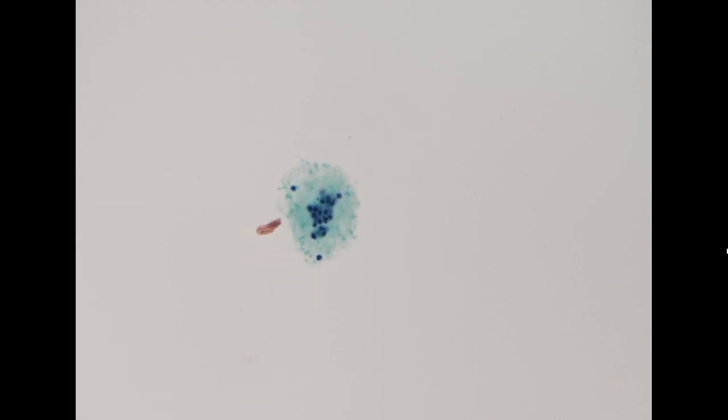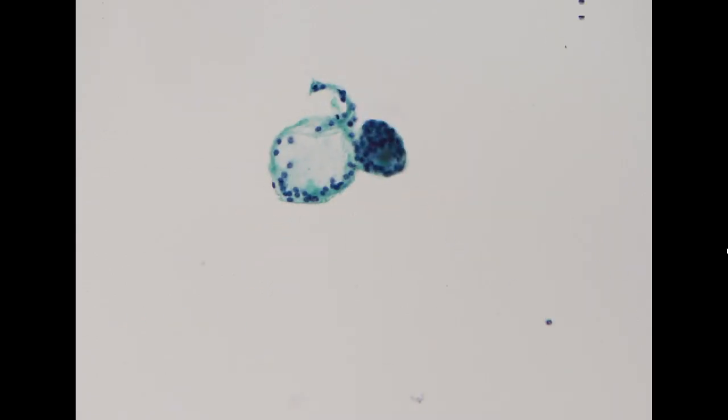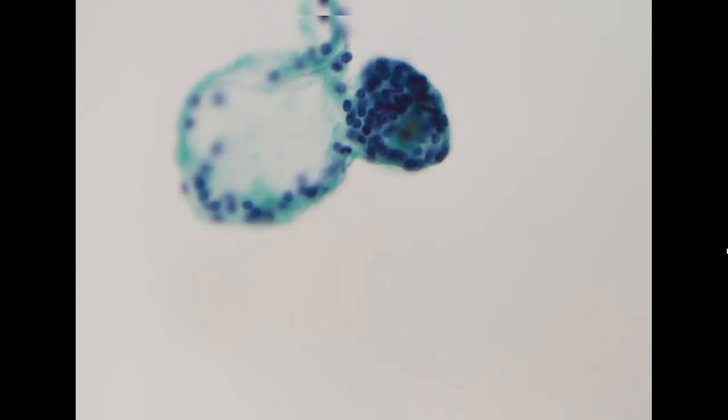Usually when I diagnose follicular neoplasm, I would check the sonography features of this nodule. I checked the sono, it is a very big nodule and it looks like a follicular tumor with a rounded contour and hypervascularity around this nodule. So this is consistent with follicular neoplasm. We will send out the case as TBS category 4, suspicious for follicular neoplasm.